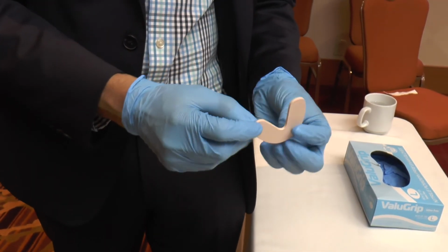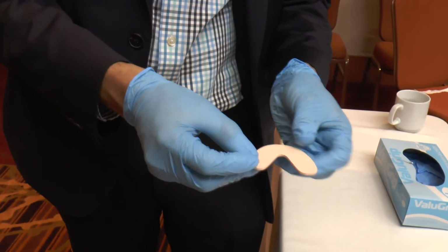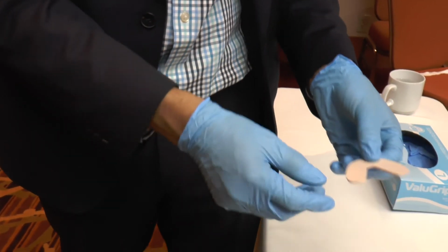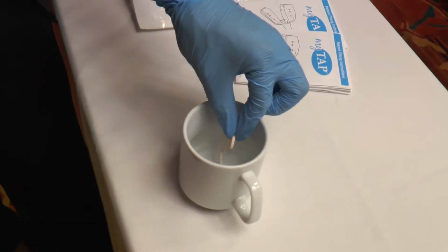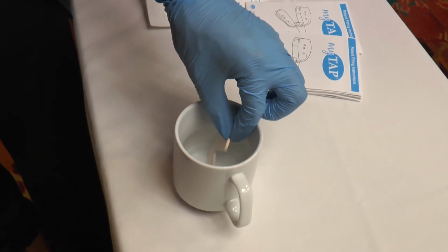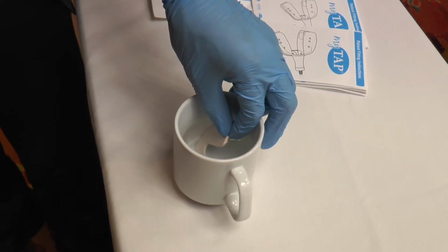So first we need to mold this to fit our patient's bite. And the way we're going to do that is take the wafer out of the bag and place it once again in some nice hot water. Just be careful if you immerse your fingers, because it is very hot water.